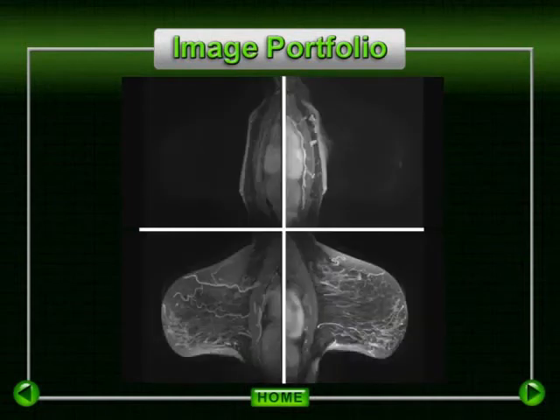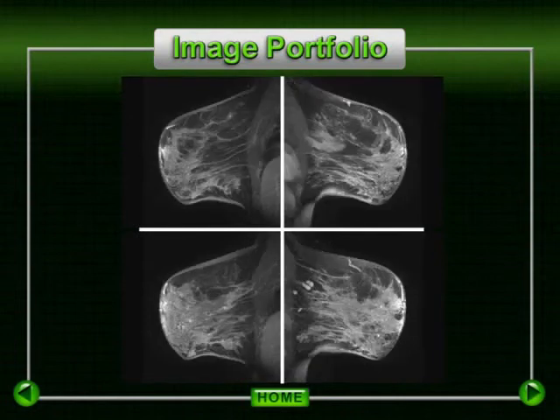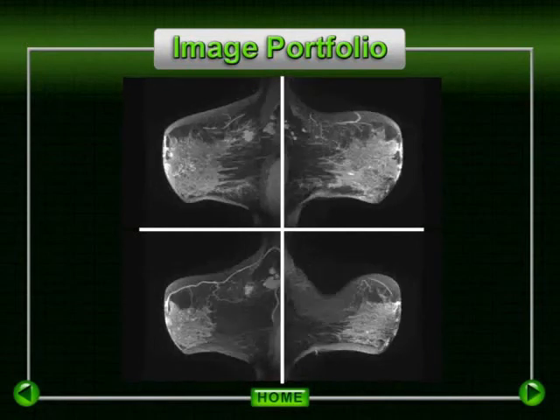When utilizing our parallel imaging techniques with fat-saturated dynamic acquisitions, we will then film the 1-minute fat-saturated thin MIPs, always proceeding from superior to inferior in an axial parallel acquisition, or from medial to lateral, beginning at the internal mammary arteries with a sagittal acquisition. In the case of a negative or normal MRI, this completes the portfolio.